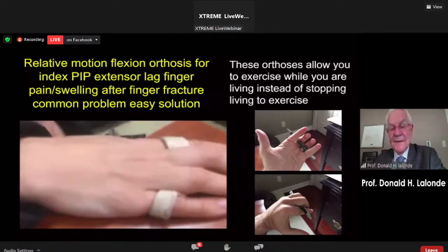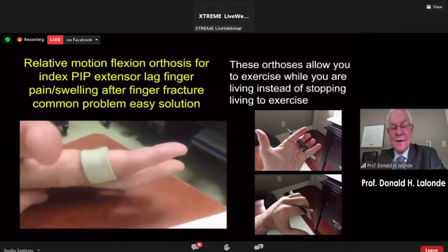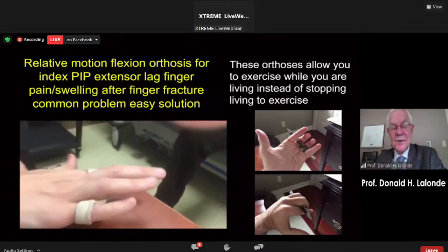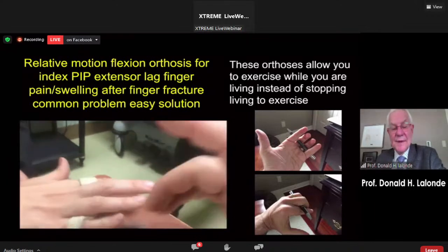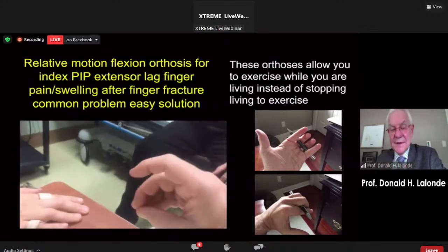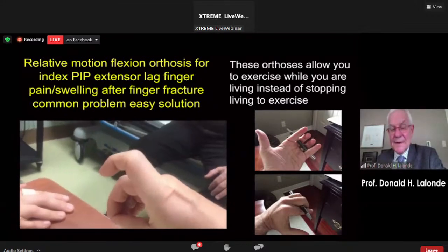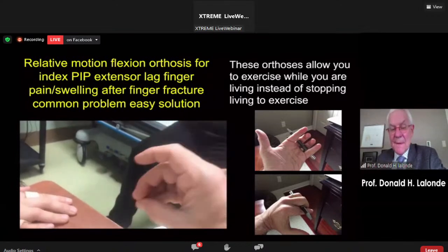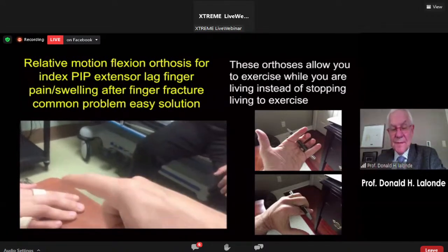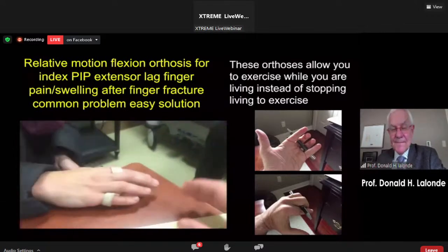And so we put her in this relative motion flexion splint, which forced extension of the PIP joint. And the problem was that for 2 months, she was walking around like this, ignoring the finger, and then couldn't extend it because of hyperextension of the MP joint and just ignoring it. So this forced her to use the finger again. It forced it to extend. And she's been wearing it 24/7 for a month.